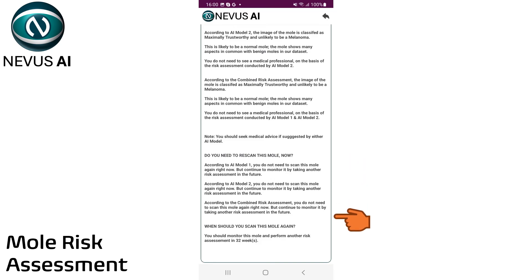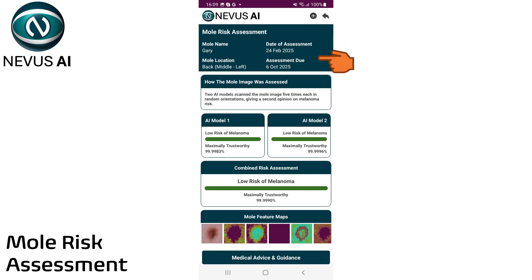Depending on the risk score of the assessment, Nevis AI will calculate when you should scan this mole again. This is the assessment due date. The higher the risk for melanoma, the more frequently you will be asked to scan this mole again.